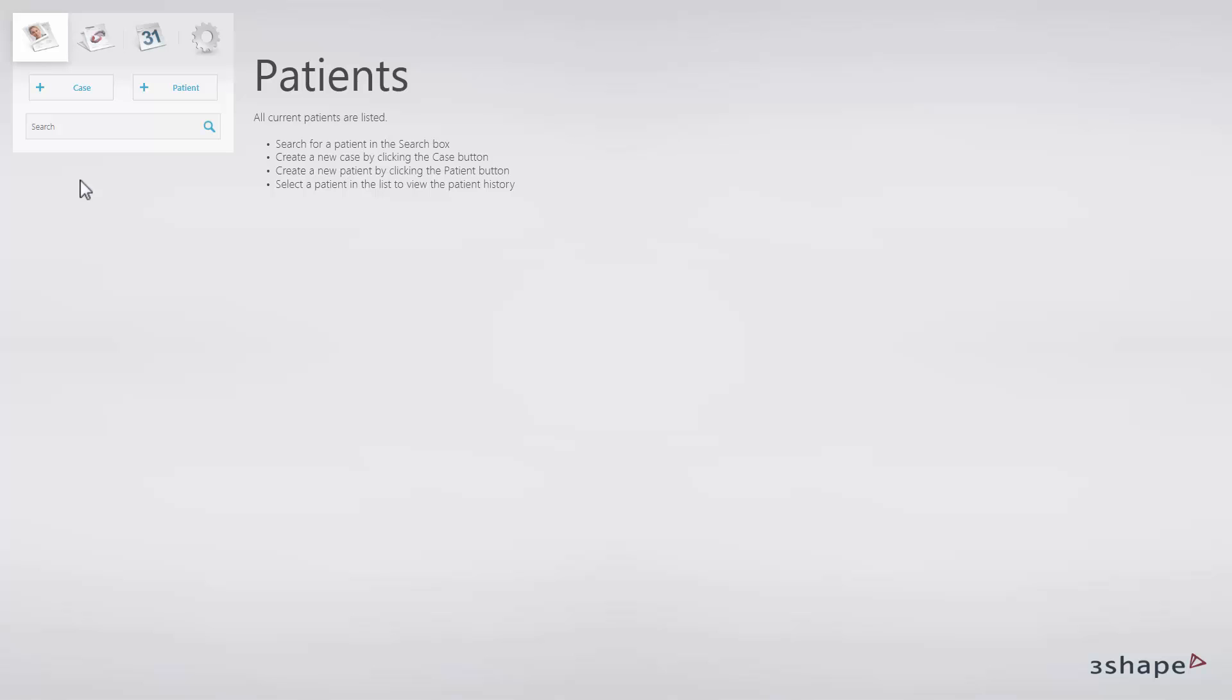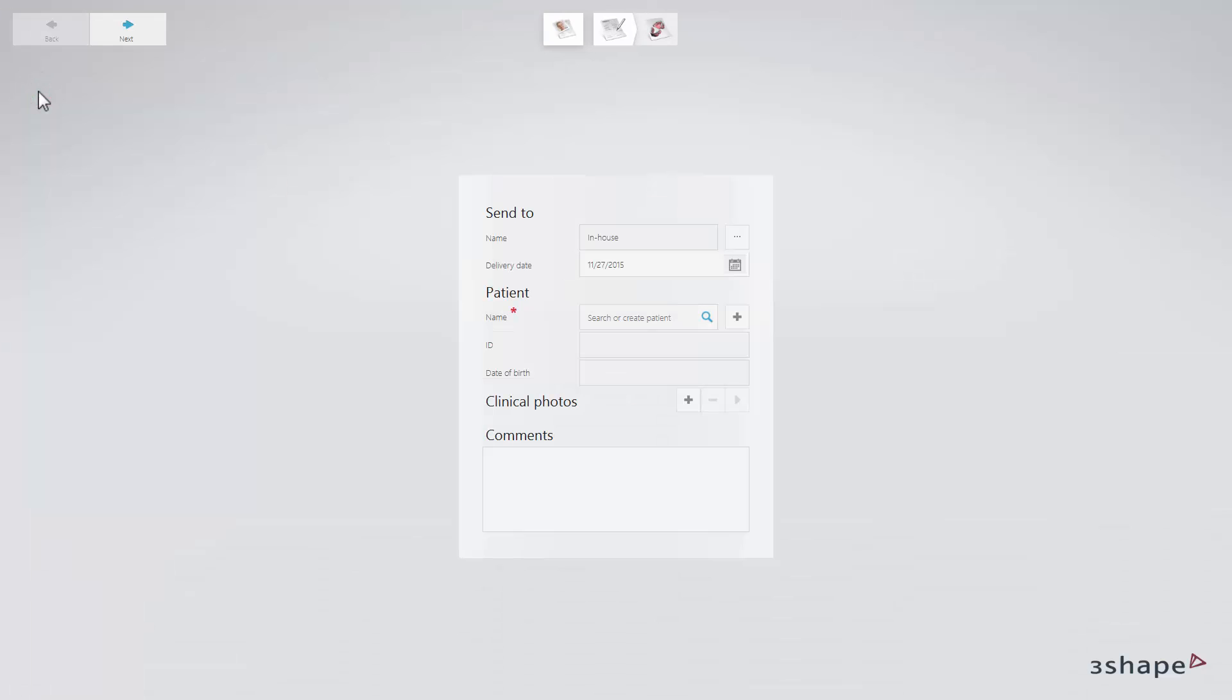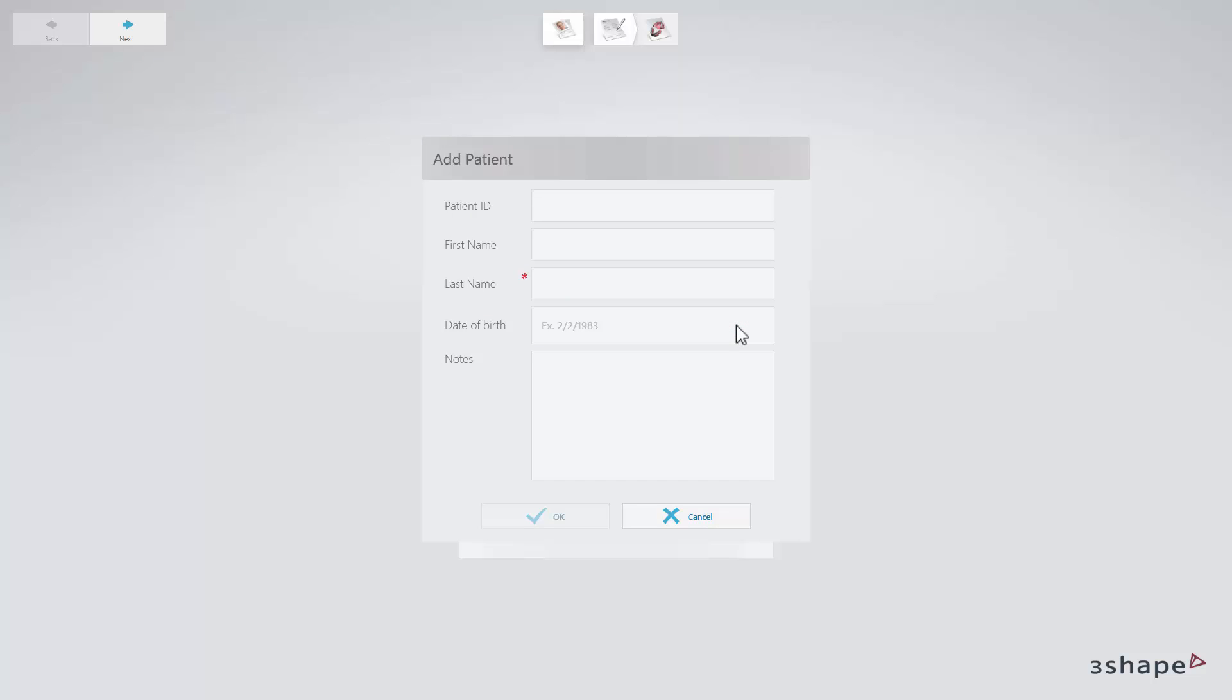To create a new case from the case overview, click the Cases tab and the Case Manager will appear. To create a new case in the Case Manager, click the New button and the Indication Settings page will appear. Search for existing patient names or create a new patient name by typing in the relevant name and then clicking Add New Patient.